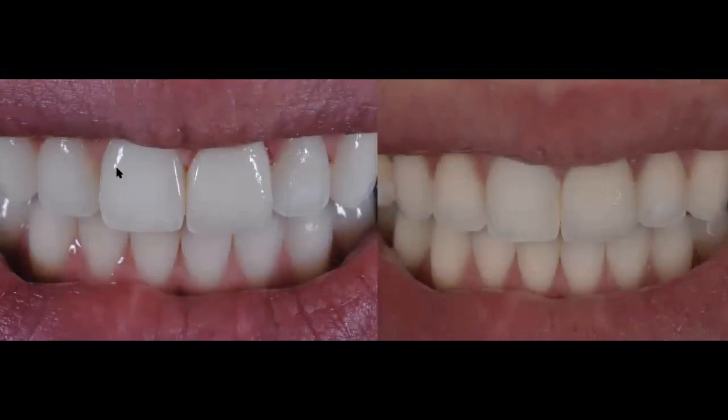And this is the day of cement delivery. You can see the tissue a little bit irritated there, but look at the color. Look at the incisal third. Look at the way that the lab was able to recreate nature. This is the cross polarized photo of the restoration the day of cementation. And look at both restorations. I mean, this is, in my mind, an acceptable restoration.